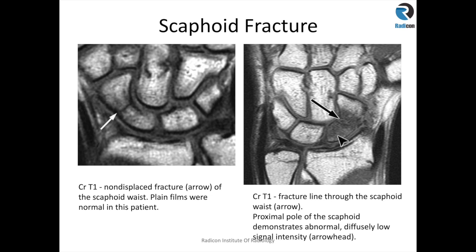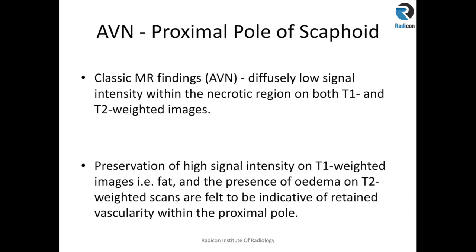In this second case, you can see there is a low T1 signal intensity, somewhat more extensive than in our first case. There are also signal changes within the distal and proximal poles of the scaphoid, more extensive. You can see the normal fat signal in the lunate, but here this is all more intermediate signal. STIR sequences will demonstrate marrow edema. The classical findings of avascular necrosis are diffuse low signal within the necrotic region on both T1 and T2 weighted sequences.